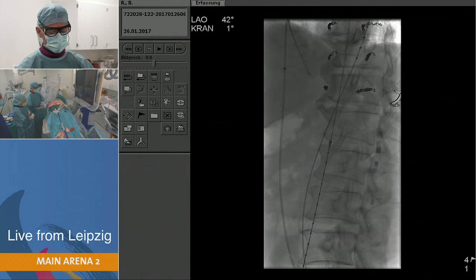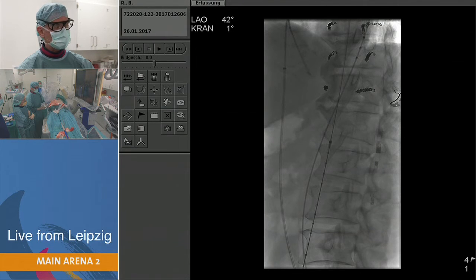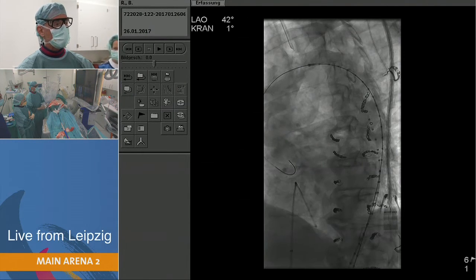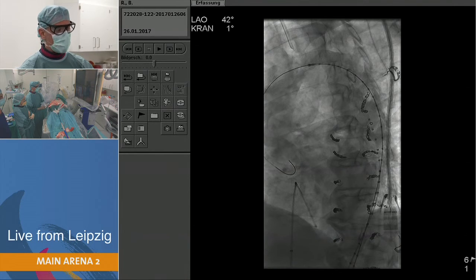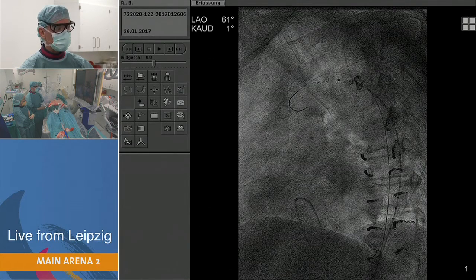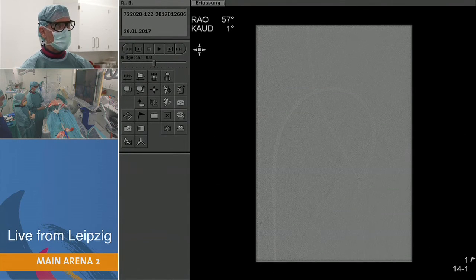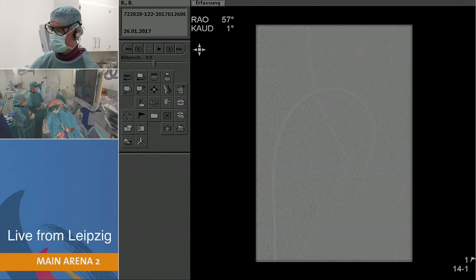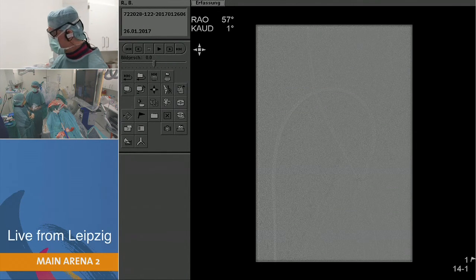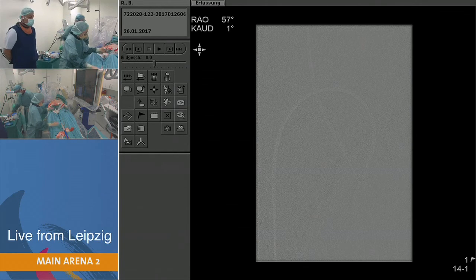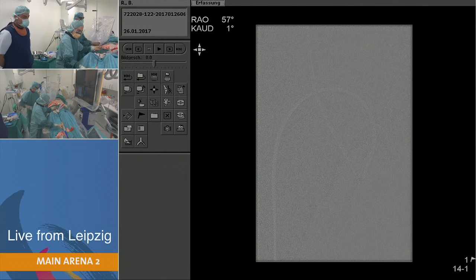Then we want to take another 200 by 32 cylindric graft. Here you can see all the coils from the previous sessions. We also have a pacemaker for rapid pacing during graft deployment. We are just about to introduce the graft via the right groin, having already pre-dilated with a 16-French sheath. Here is the Ankura graft live.